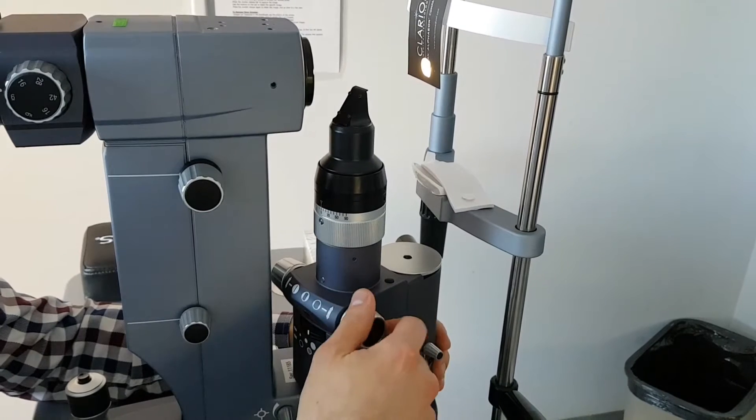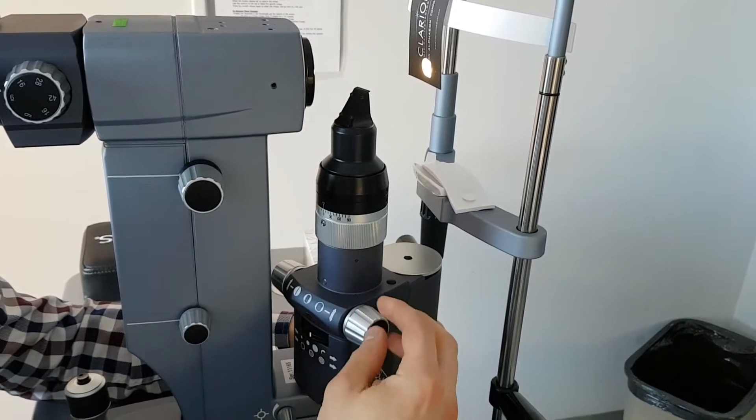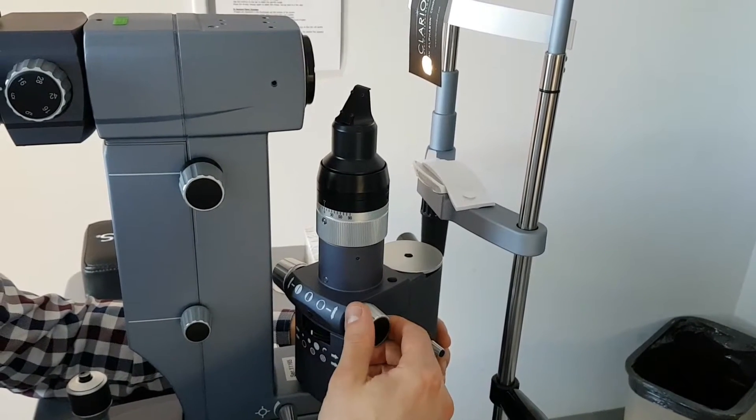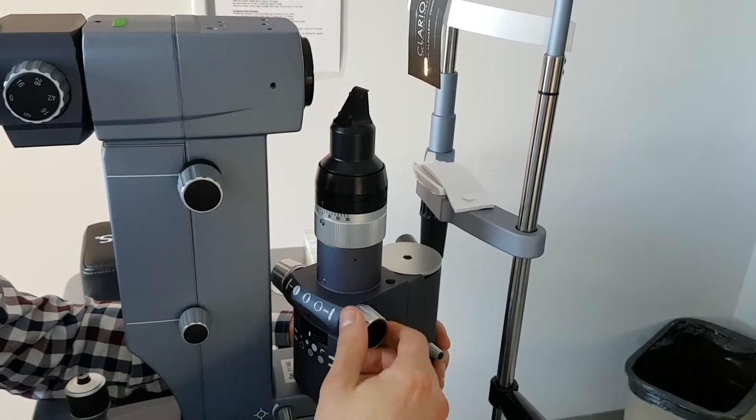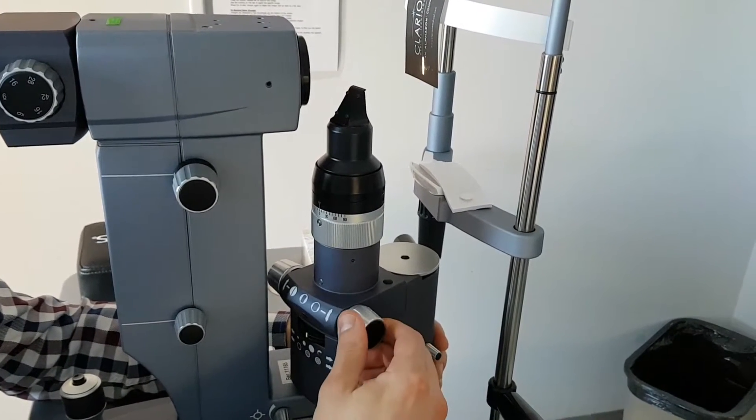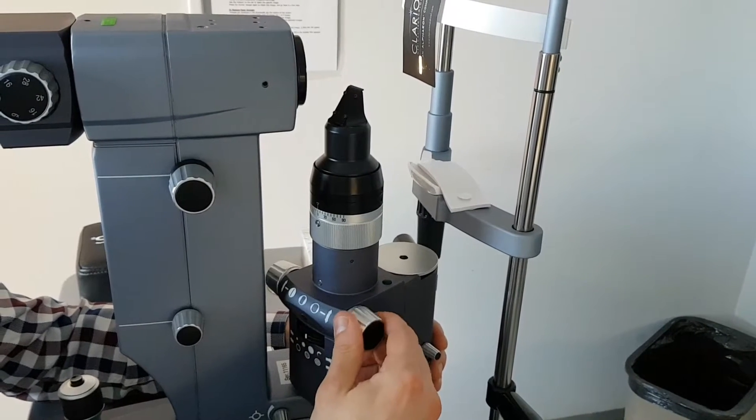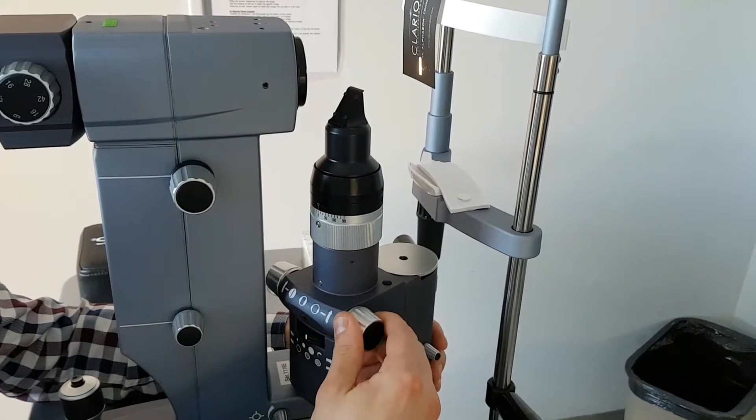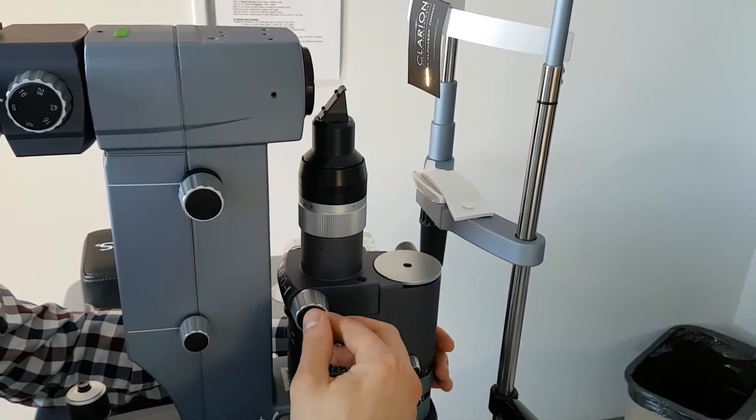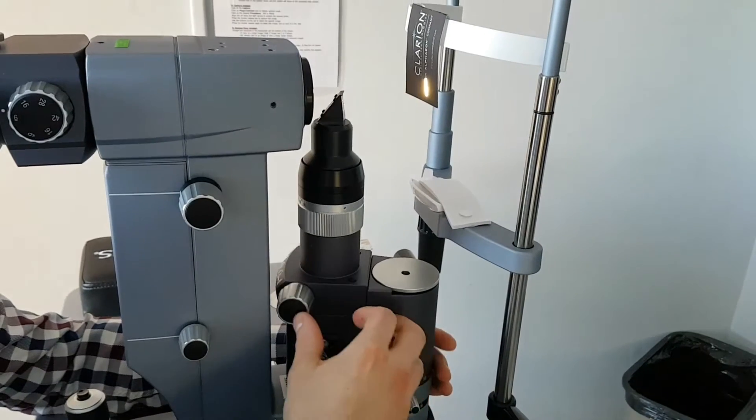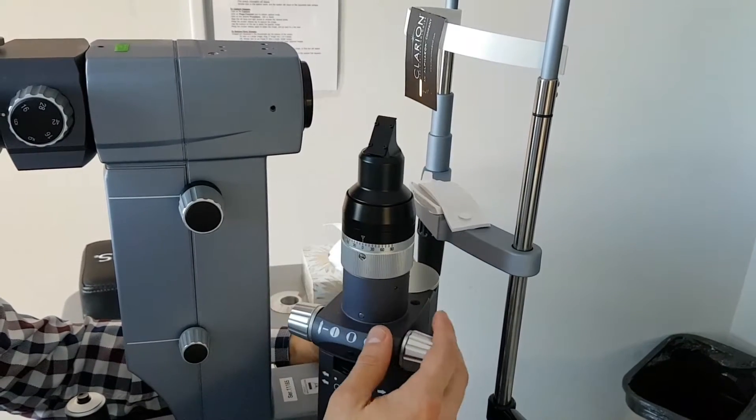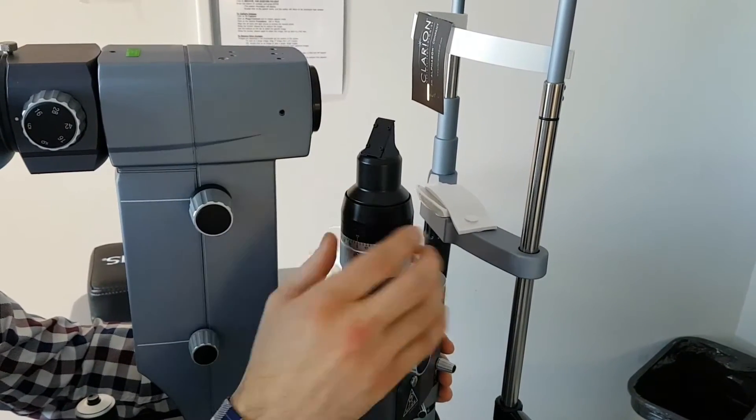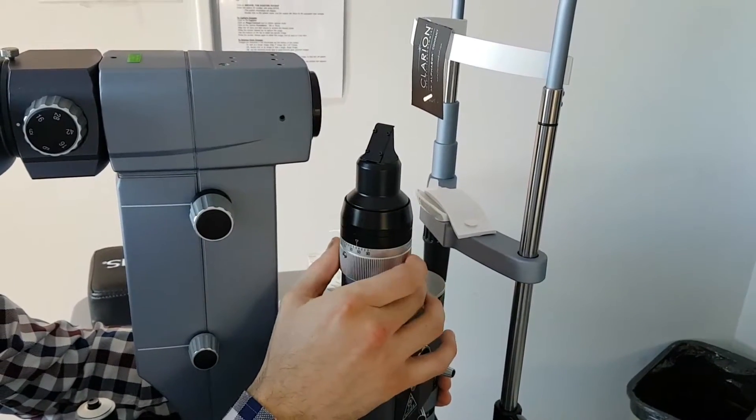Once you've done that, you have those wheels here that will control the slit width. And this is pretty much it for the... no wait, there's a second one here.